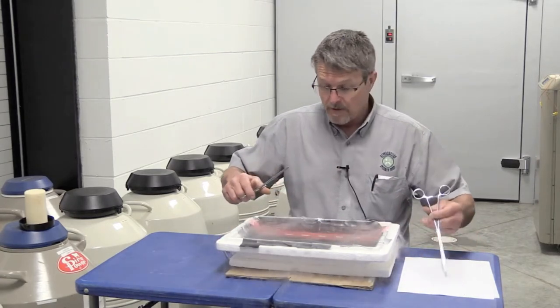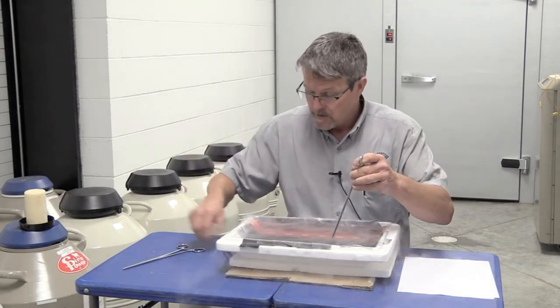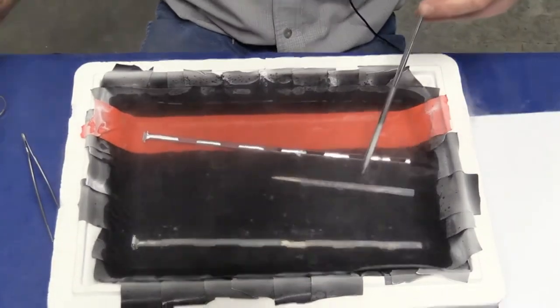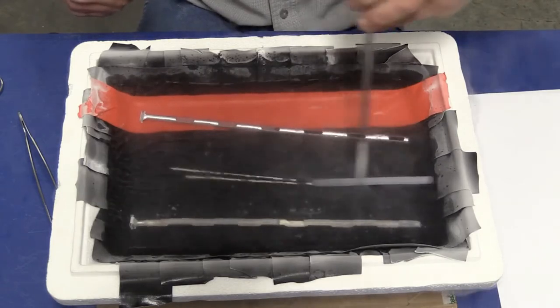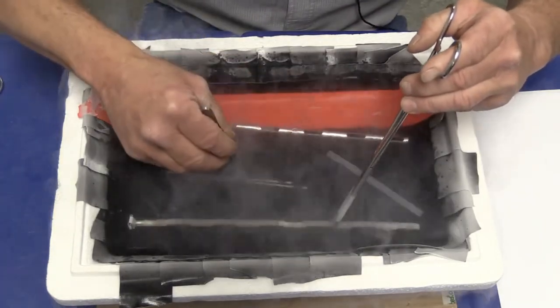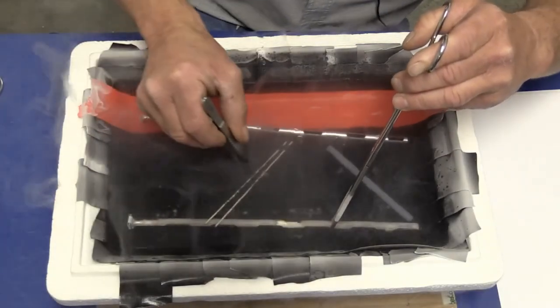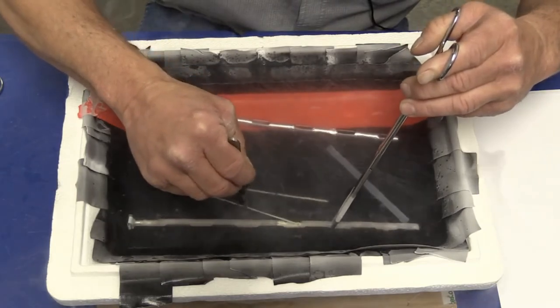Now we're going to pull the cane out, or you can actually move out the number of straws that you need. There's a pair of tweezers here and we're just going to take two out of one of the goblets and add those two straws to the goblet that we want them in.